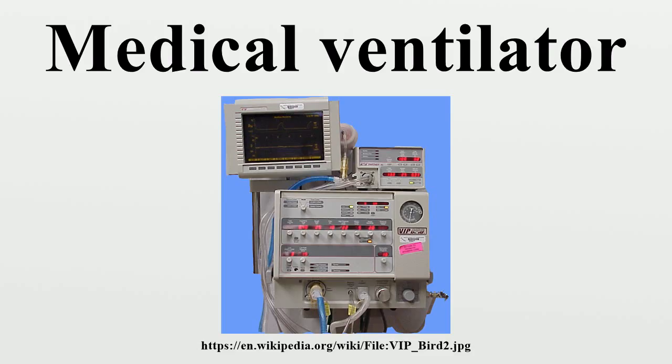An incoming gas flow was used to lift a weighted bellows unit, which fell intermittently under gravity, forcing breathing gases into the patient's lungs. The inflation pressure could be varied by sliding the movable weight on top of the bellows. The volume of gas delivered was adjustable using a curved slider, which restricted bellows excursion. This was a robust unit, and its availability encouraged the introduction of positive pressure ventilation techniques into mainstream European anesthetic practice.